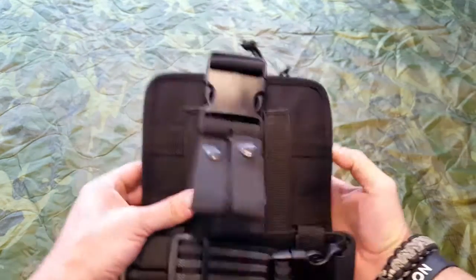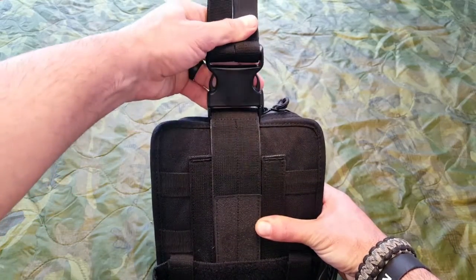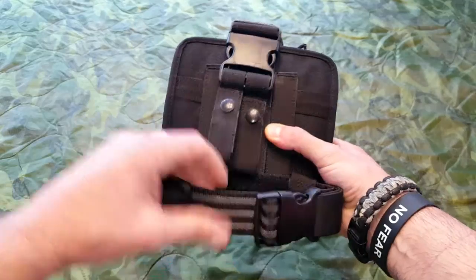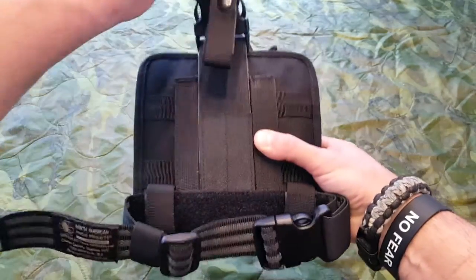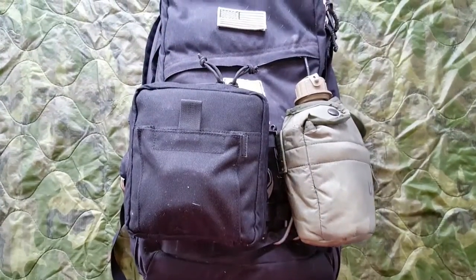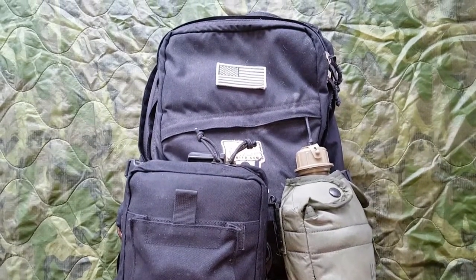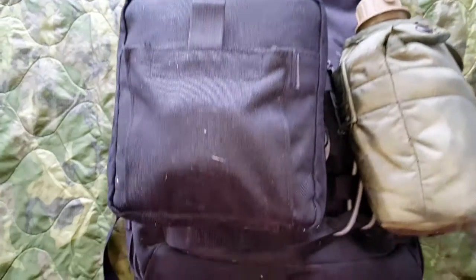There are actually three ways you can attach this, and probably more if you're creative. You can attach it to a duty belt or a tactical belt. You can also attach it to your leg — it does come with a second strap, but I took it off for my purposes. And as we discussed, it can attach to your MOLLE setup, which is what I usually prefer when I have it with me in the field.